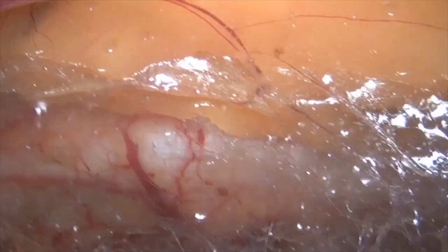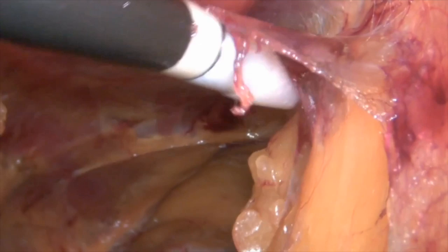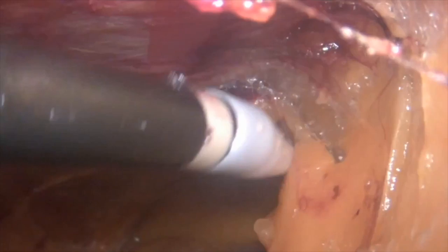So that is the pubic symphysis and the Cooper's ligament seen clearly. Once that space is open, then we come to the midline. Here there was a lot of fat in this patient because of the visceral obesity, and here you can see how much energy is required to really take down this fibrous attachment in the midline. So this is what we were trying to emphasize on the conventional TEP as well.